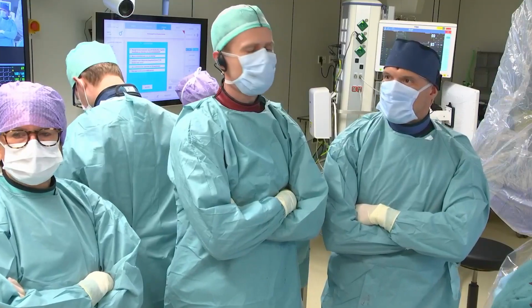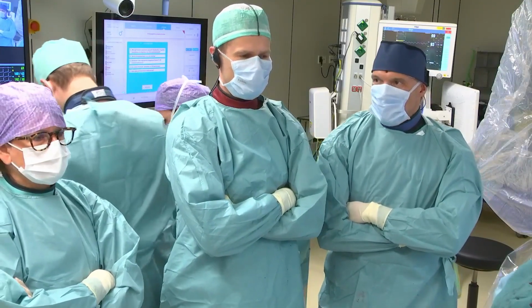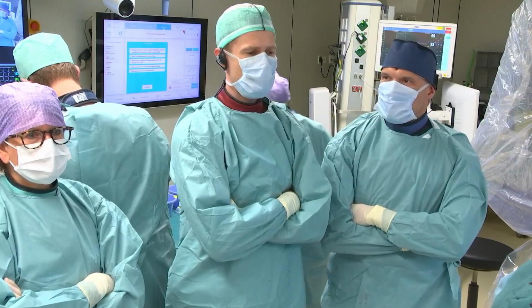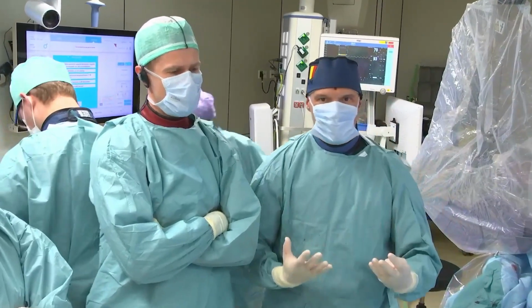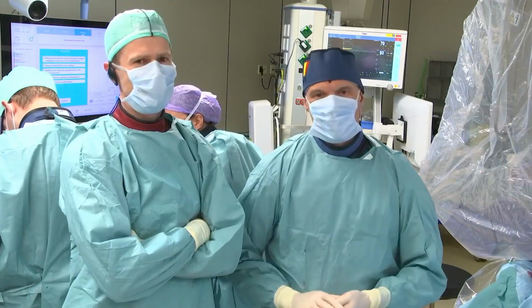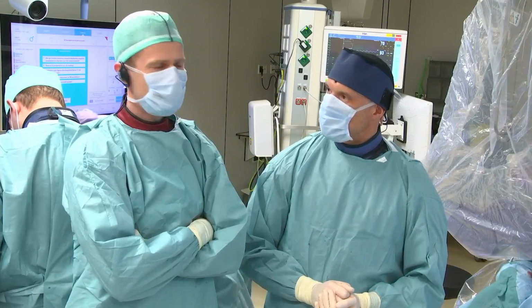But we have a little bit of a peculiar patient. It's a really challenging case. We had some difficulties in planning this patient because we had serious doubts about the access. But this is also what TIO is all about, right? We want to show practical issues that you face in your own practice and how to deal with them through creativity. So, Rutger Jan, why don't you start with presenting the patient?